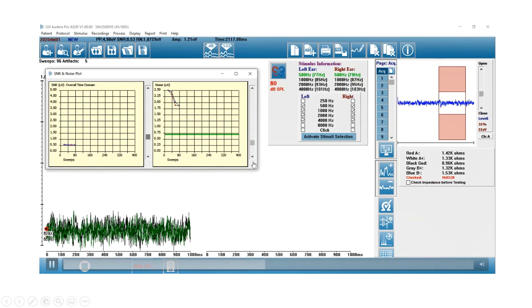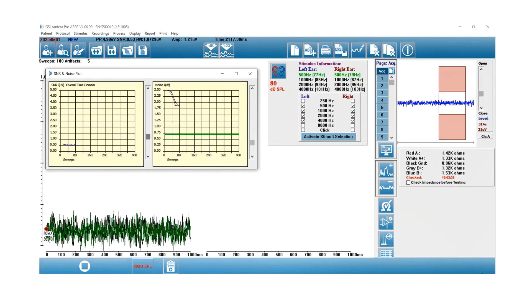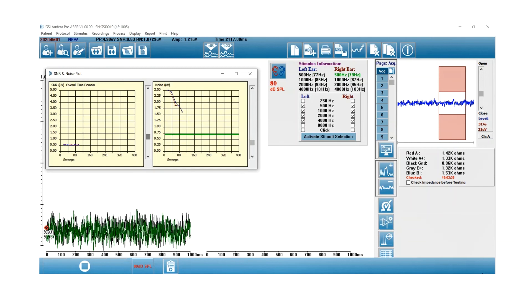If you look at the stimulus information under the left and right ear, you can see 500 hertz has turned green for both ears. When that happens, that indicates that a significant response has been obtained at that frequency.